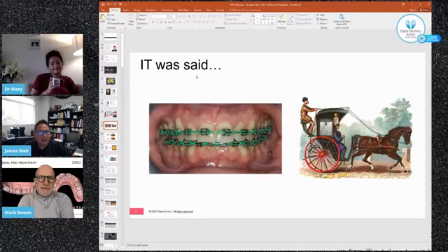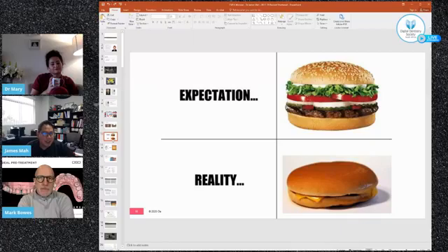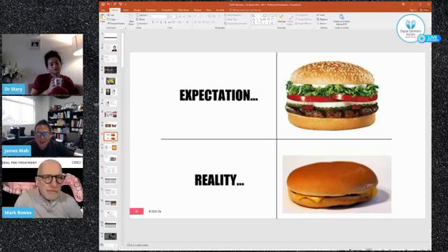But the problem with this kind of representation and marketing, particularly to patients, is it led to high expectations, and people thought it was an easy thing, and then they got into it. And one of the biggest myths in the aligner world, and it still is perpetuated, is that a patient simply wears a series of appliances on a prescribed schedule, and then, insta presto, voila, they have a pleasing correction to their malocclusion. And I use the word myth because if we look at the literature, it rarely, if ever, works out that way, perhaps in very, very minor malocclusions. But in most cases, you need a clinician to intervene and do something to make the system work.